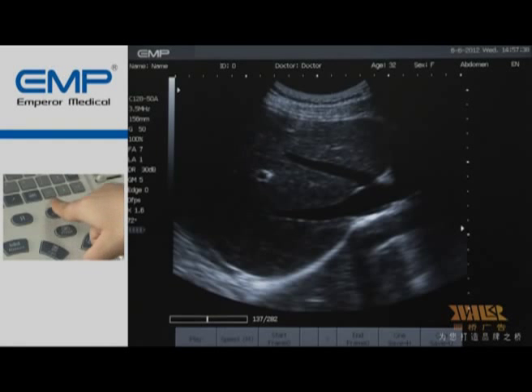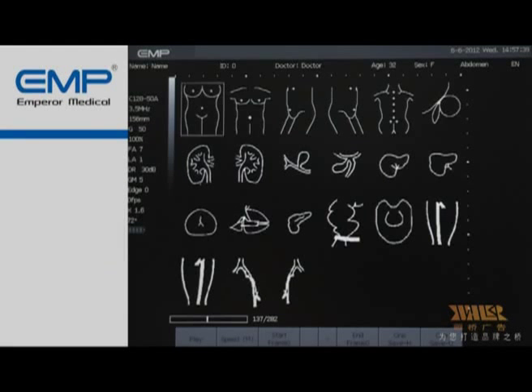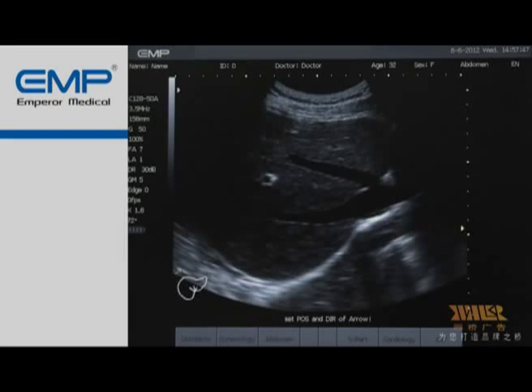When the image is frozen, the body marks light will be on, and the menu becomes like this. Press F1 to F6 to choose the department you want. Move the trackball and press the Set button to confirm the body mark you want. And then move the trackball to change the arrow position. Press the Set button to confirm.